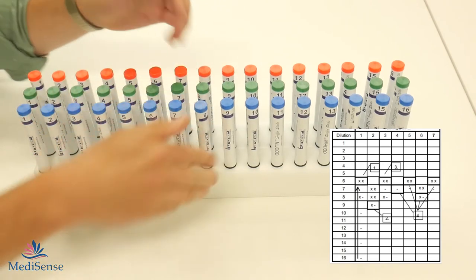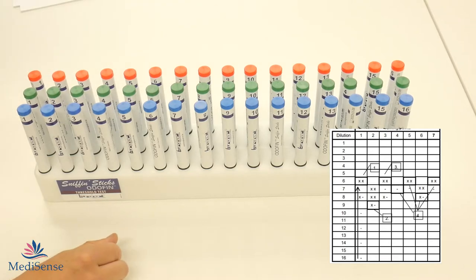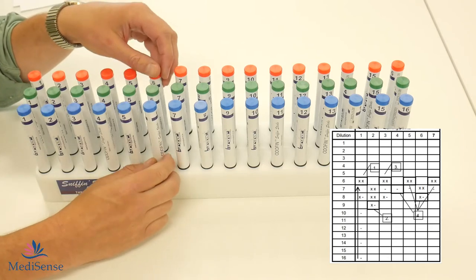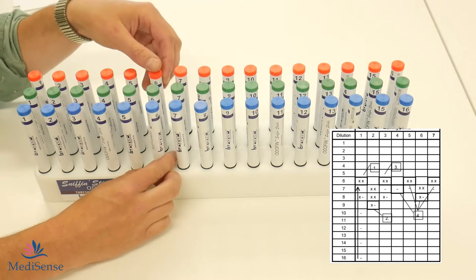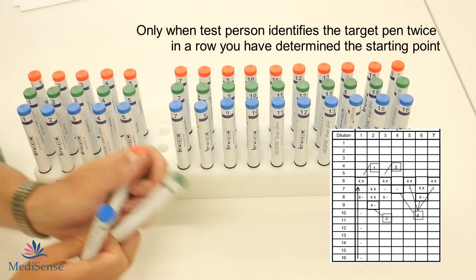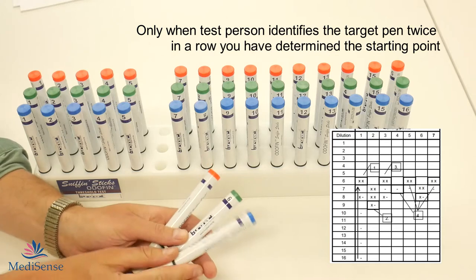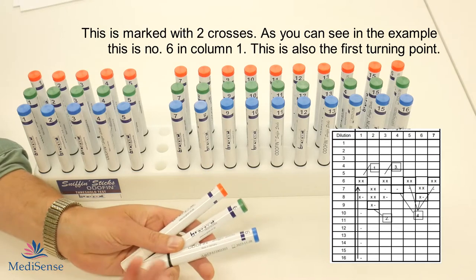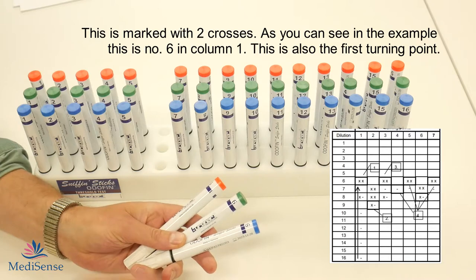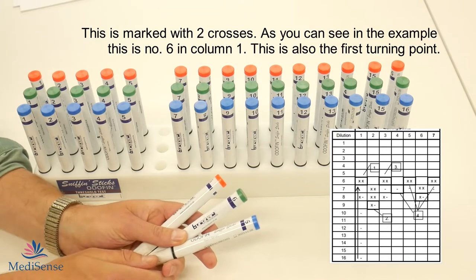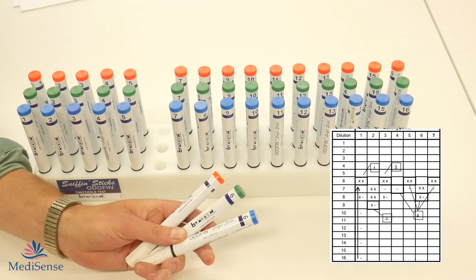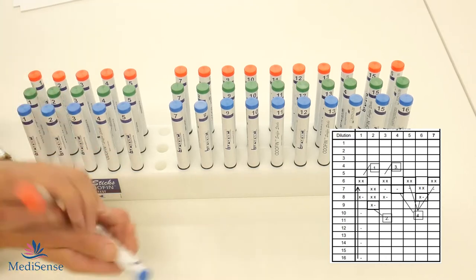If it is guessed right again then that is the start point of the threshold test. But in the example number 8 was not guessed right so it continues to number 6. And as you can see on the example in the manual, number 6 was guessed twice in a row. That means that is the first starting point and the first double cross in the first row.